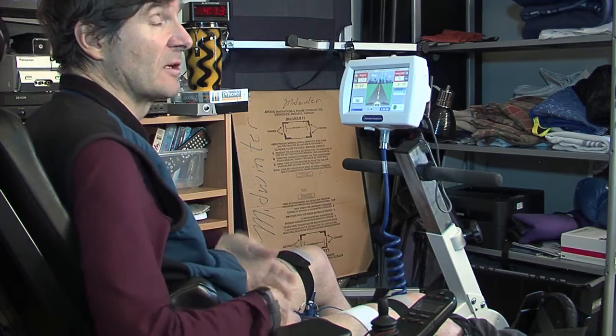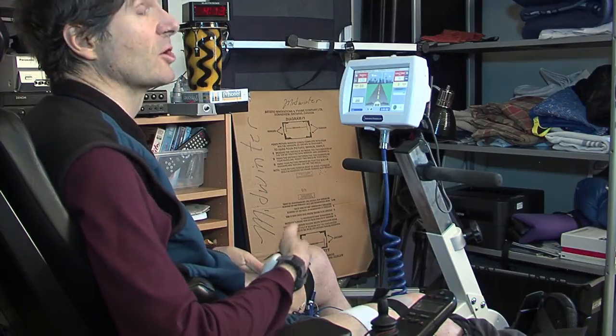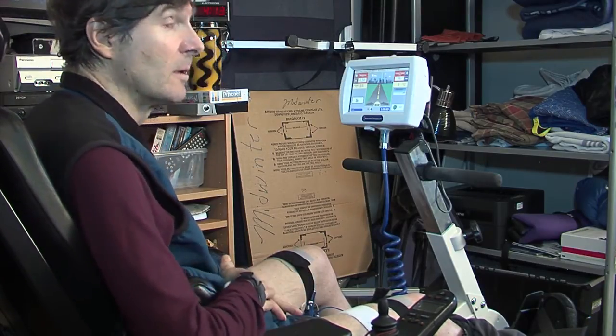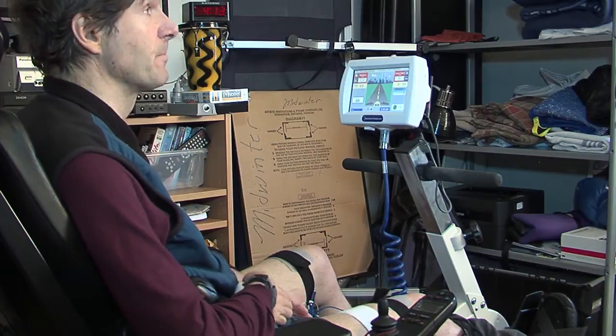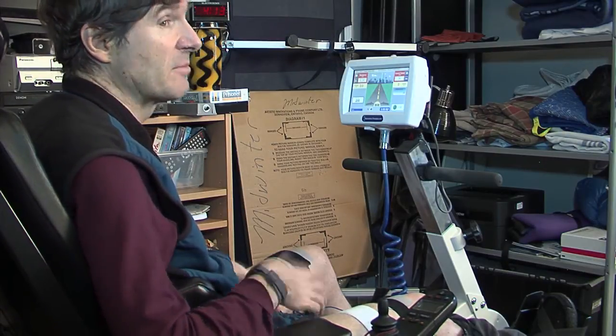This type of cycle can benefit people with a wide variety of neurological problems, ranging from complete spinal cord injury to incomplete spinal cord injury, multiple sclerosis, stroke, and other types of weakness.